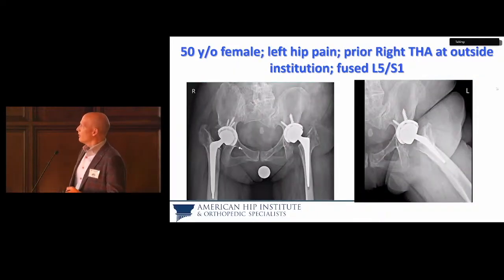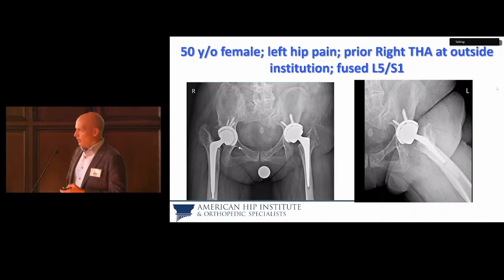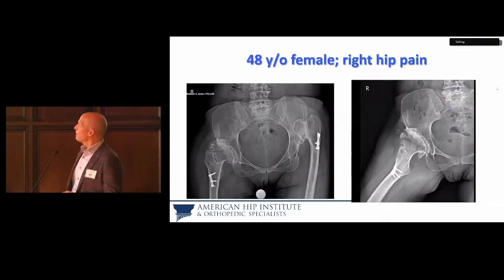Again, cups maybe a little higher than otherwise, but her leg lengths look pretty good. I cemented that stem in, the version that I wanted it in. She felt nice and stable, still doing well. Large head.